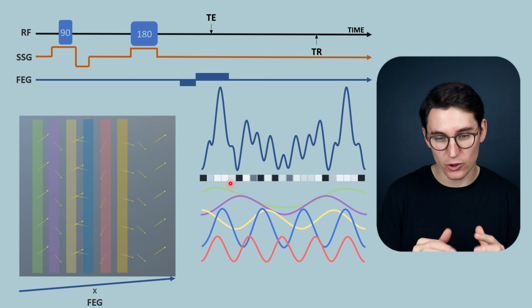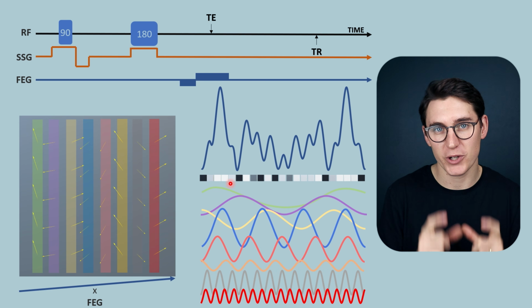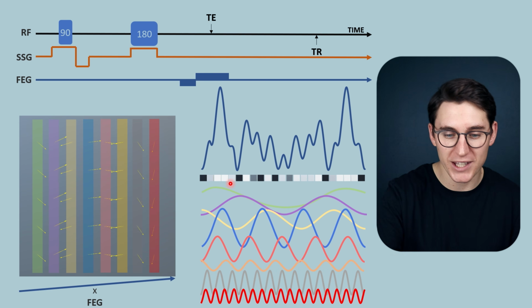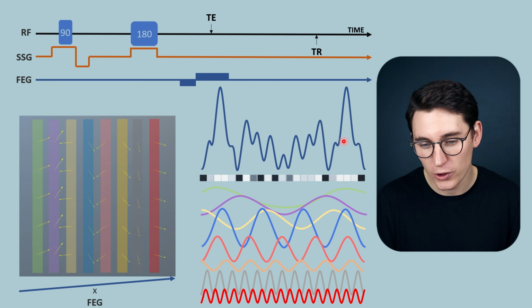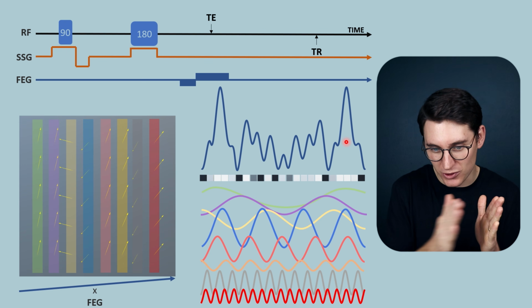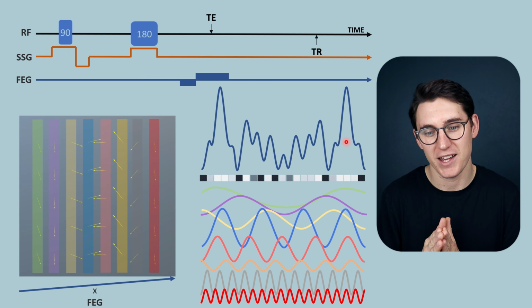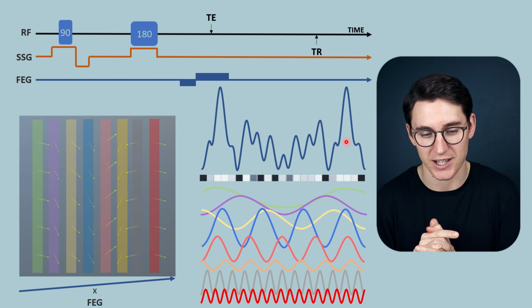And what we can do is use this mathematical equation to figure out which unique combination of frequencies and amplitudes will give us this specific signal that we read out. Only one specific set of frequencies and amplitudes will give us this unique signal that we've read out. And that transformation is what's known as a Fourier transformation, which we're going to look at today.